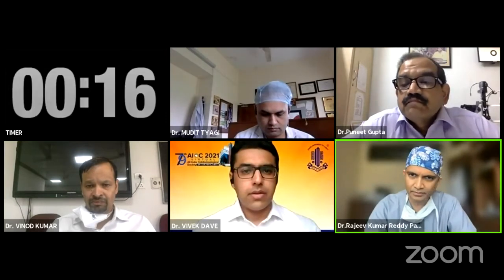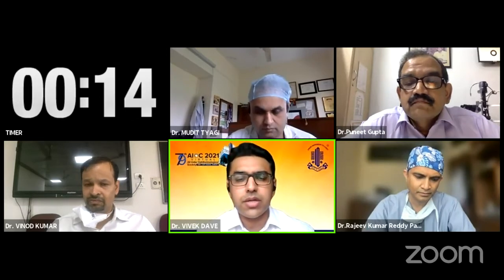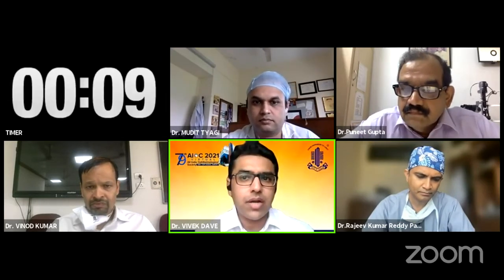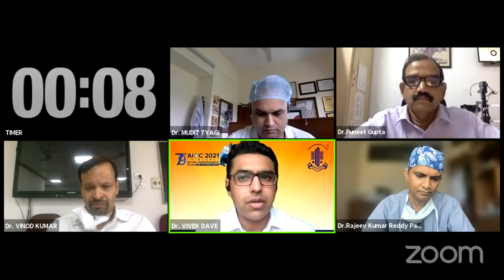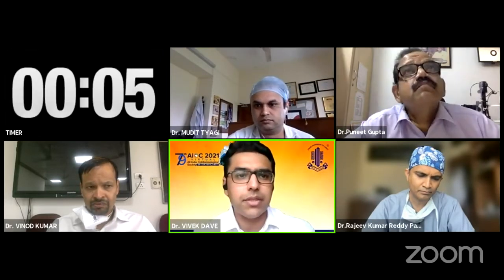Okay, so I have also had one observation during diagnostic endoscopy. Sometimes one is not able to clearly gauge if it's a shallow retinal detachment or an attached retina. At that time, we may require one additional port and try to give a small peripheral laser burn to be sure that it's the attached retina, possibly due to the lack of three-dimensional perception that we have.